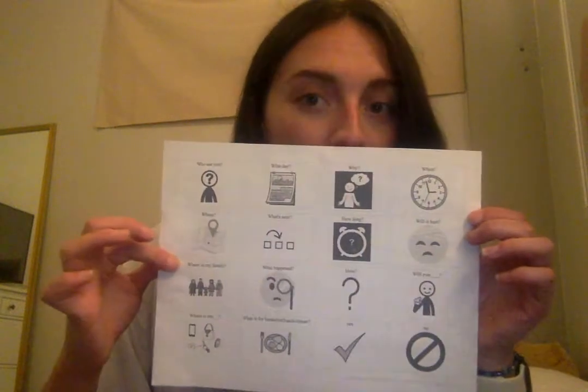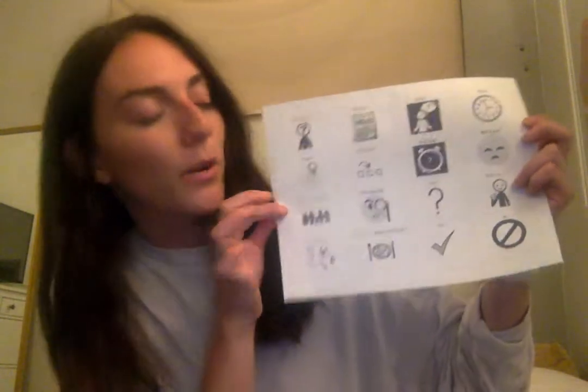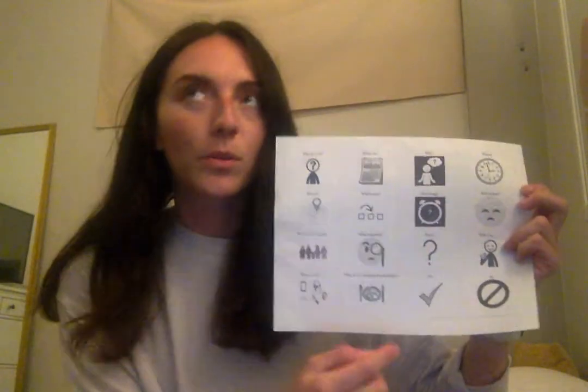And so if you were looking for additional communication support, please contact your speech language pathologist to learn more about AAC supports and other devices. Like I said, this was a pretty low-tech board, and the individual would just need to learn how to point to the question that they are asking in order to effectively communicate with nurses or other hospital staff.